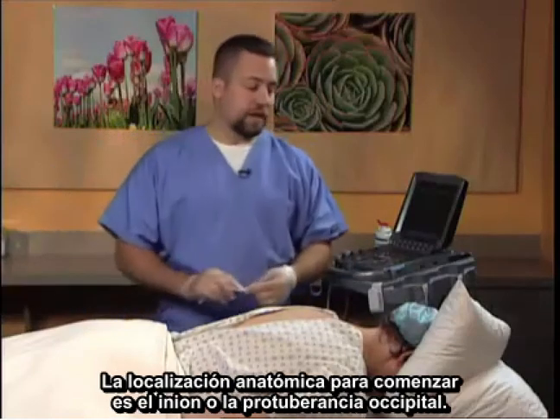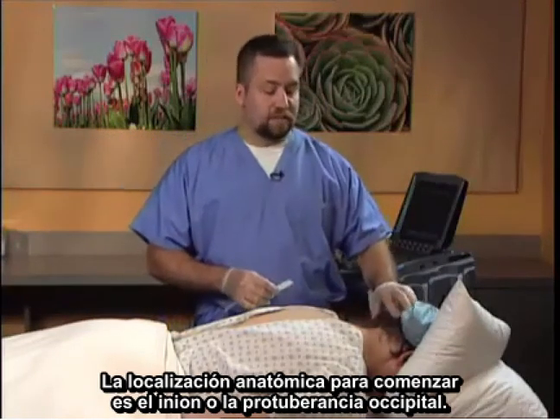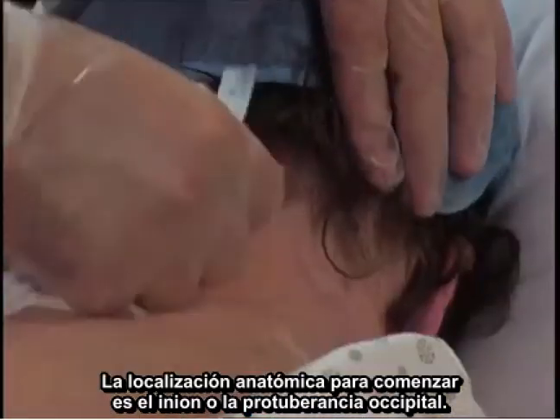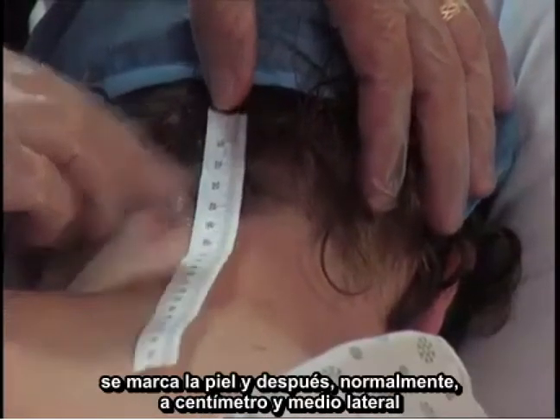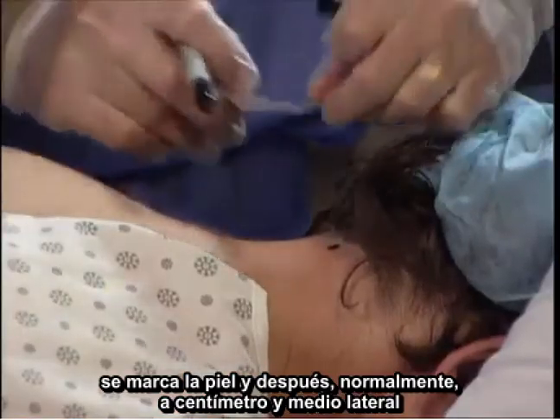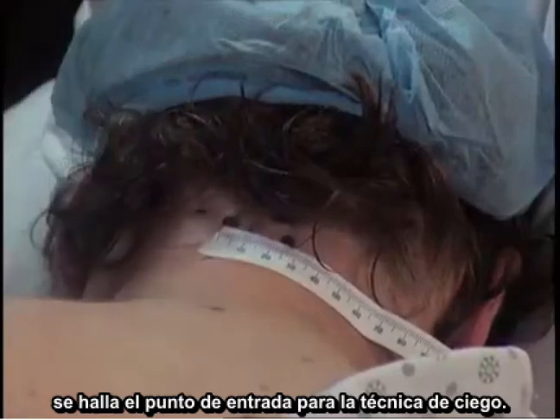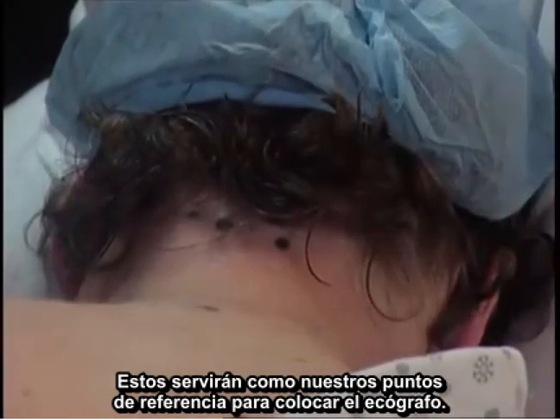The anatomic location to begin is the inion or the occipital protuberance. Three centimeters below this, the skin is marked, and then typically one and a half centimeters lateral to that is the entry point for the blind technique. These will serve as our landmarks to place the ultrasound.